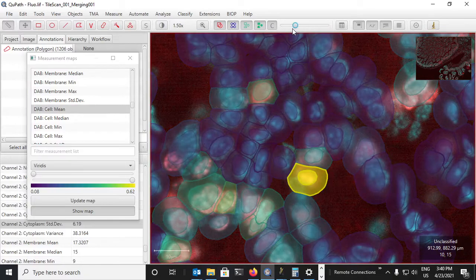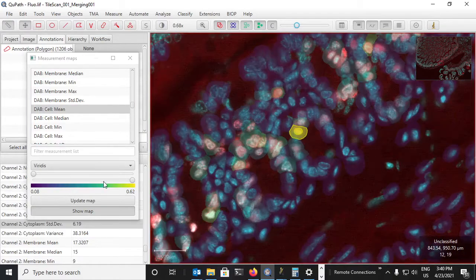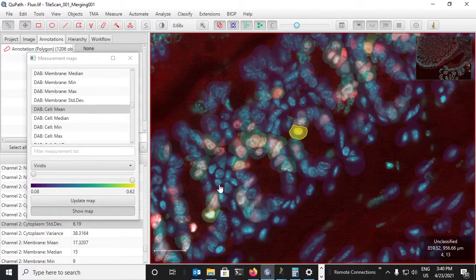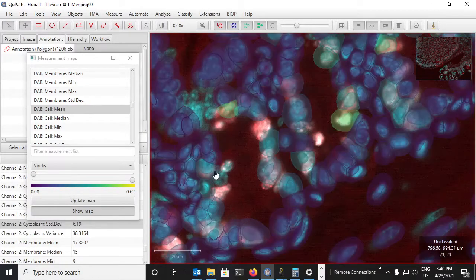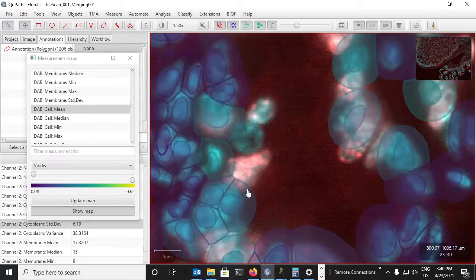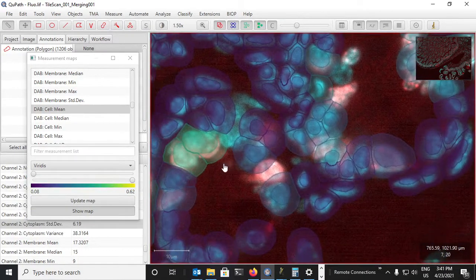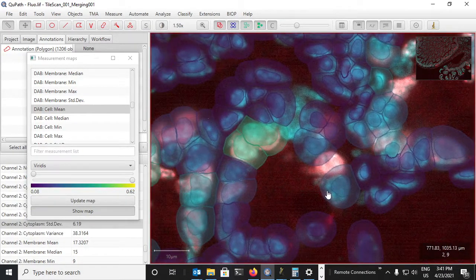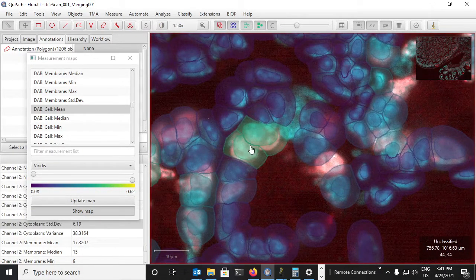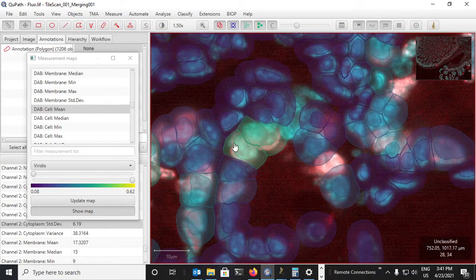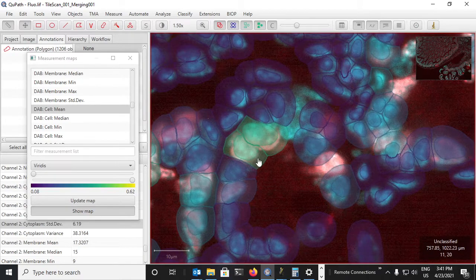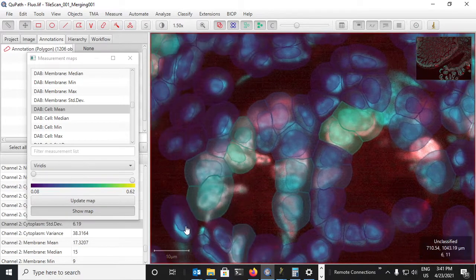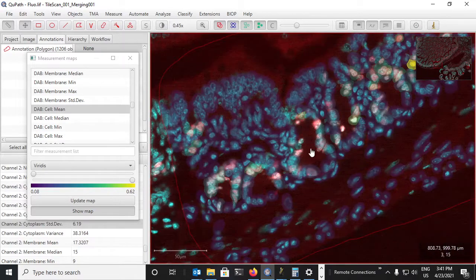Add a bit of transparency and we can see, to some extent that will depend on the accuracy of the detection of course, but we can see that where the DAB signal is high, there is also red signal.